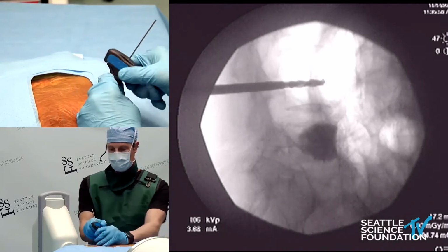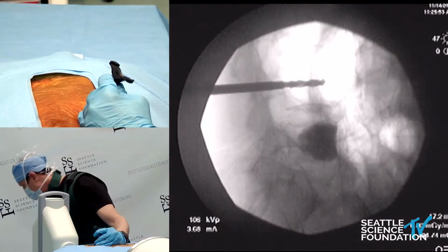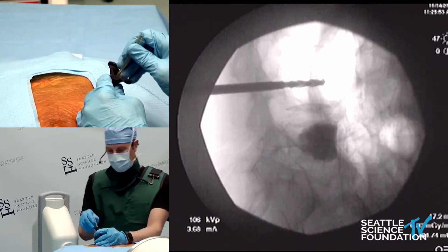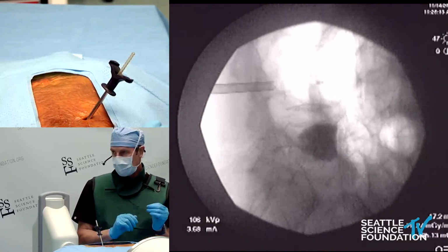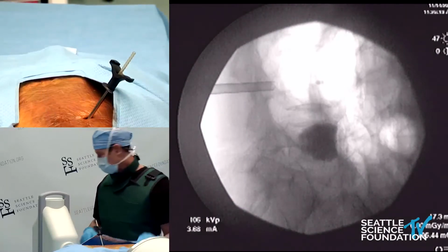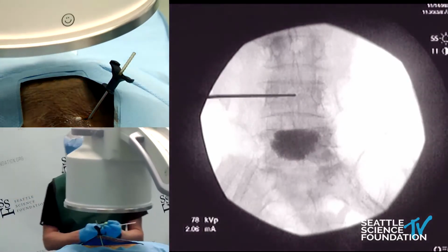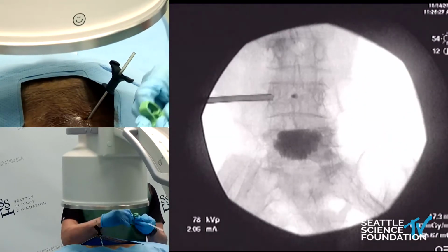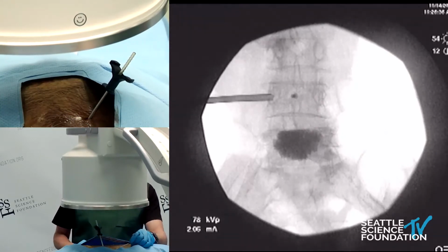And so what we do there is we pull it out, leave the working channel in, and the wire and reamer come out. The acrylic plug with the radiopaque distal tip goes in. I will plug it all the way up to the front, and this stops the bleeding, provides hemostasis for access on the other side. Let's come back around. So we'll check our position there. It'll be indicated by the acrylic plug and the radiopaque distal tip, and so we'll access the other side. All right.